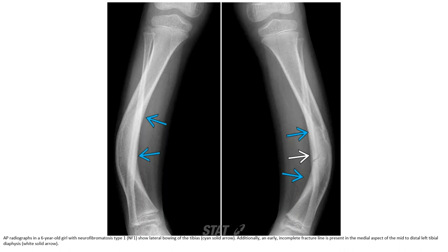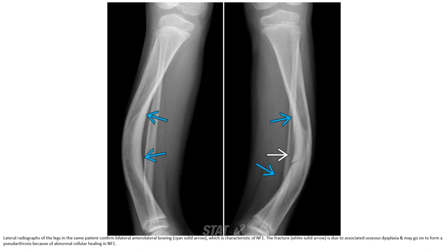In the same patient, confirmed bilateral antero-lateral bowing, which is characteristic of NF1. The fracture is due to associated osseous dysplasia and may go on to form pseudoarthrosis because of abnormal cellular healing in NF1.